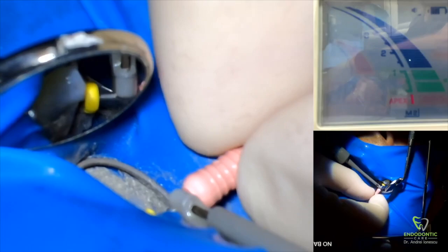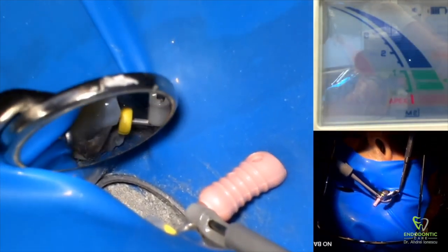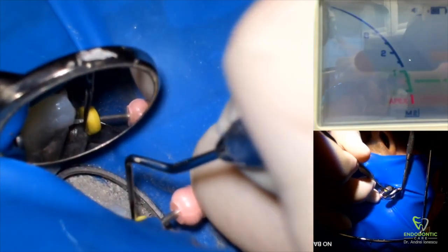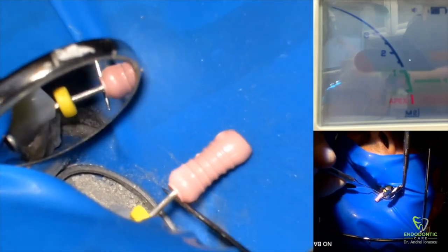Let's stop here. At this point my file is right at the working length and the apex locator is at the bottom of the green — I'm confident with this reading. What we need to do is pick a reliable reference point. I detach the apex locator and adjust the stopper so that it's right at the cusp tip. I place my mirror on the buccal such that the buccal and the palatal cusps line up, and create an imaginary line that runs right underneath the stopper. I adjust my stopper a little bit and there it is.